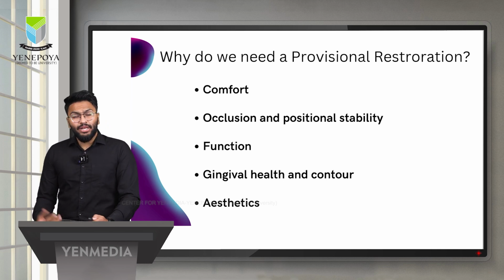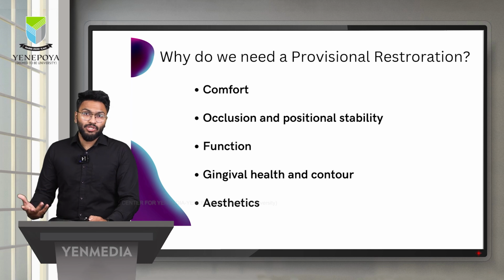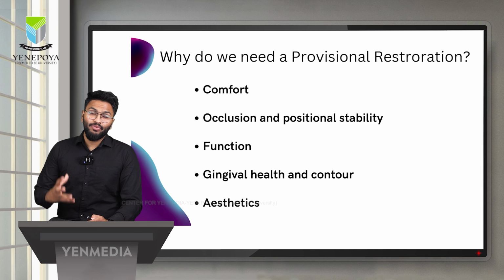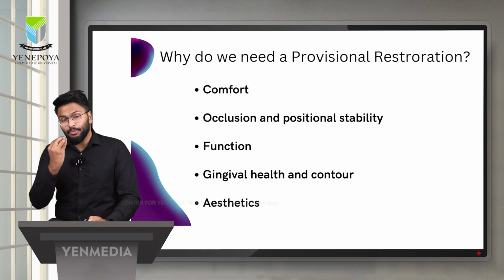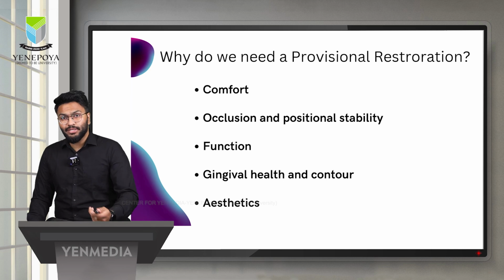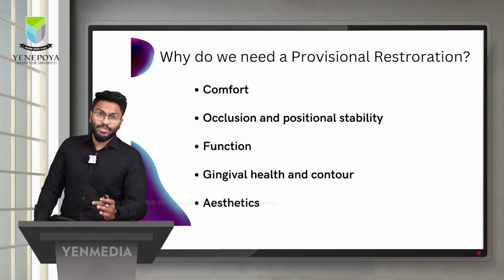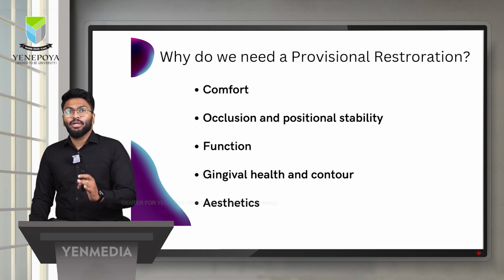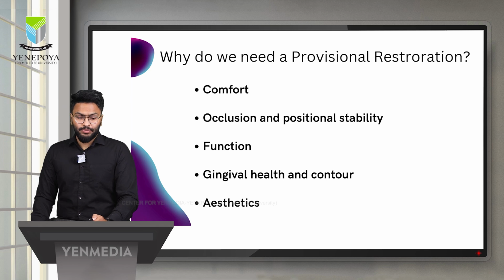As we all know, when an anterior tooth is prepared, especially in the present age, it is impossible that the patient will be happy to go around with the prepared tooth in the anterior region. So it is always necessary to regain the aesthetics, to regain the patient's confidence, and also to get an understanding of the final aesthetics which can be maintained in the patient. For the dentist, it is very important that you provisionalize the preparation.